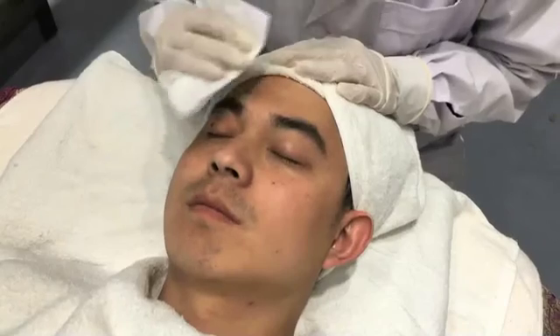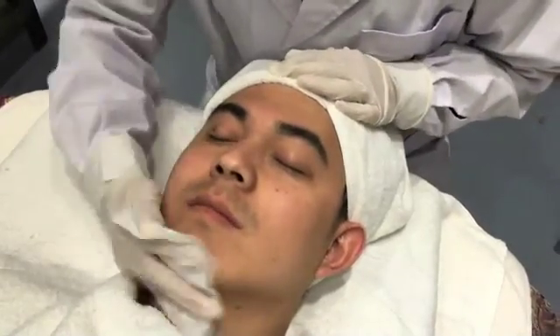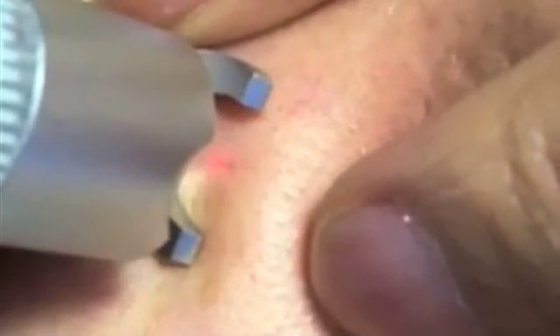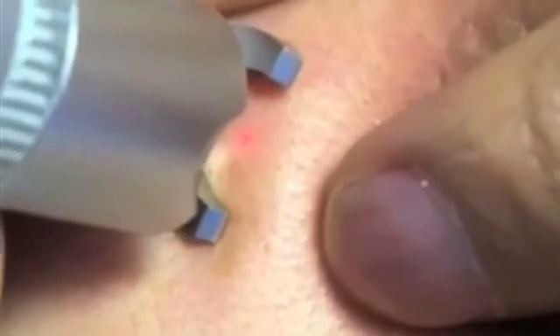Procedure of Treating. Clean the parts which need treatment. If the treatment area is large, you can apply epidermal anesthetic for 20 minutes, then the patient will feel more comfortable. Align the red beam to the vascular area, depress the foot pedal, and move the handle according to the vascular placement. You can see the vascular will disappear in no time.